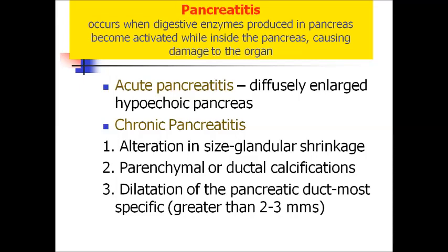Acute and chronic pancreatitis, again, only radiological signs. In acute pancreatitis nothing specific, only diffusely enlarged hypoechoic pancreas, combined with clinical symptoms, pain, and so on.